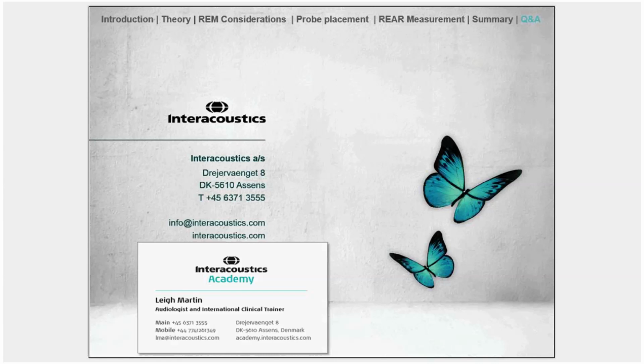In that situation, of course, then you always want to be performing real ear measurements using a speech-based stimulus. In the past, we've used noise because we've not actually had a calibrated speech-based stimuli, but now we have the international speech test signal. I would always use that stimuli when performing real ear measurements.